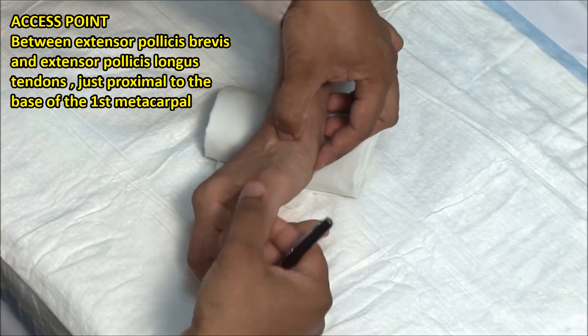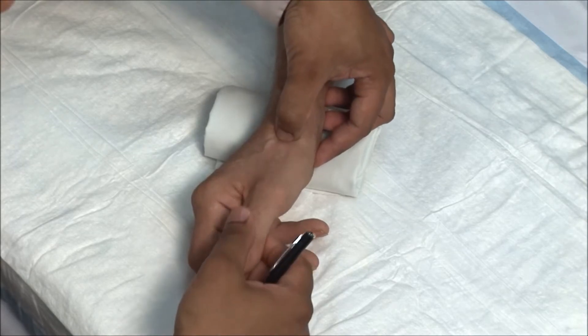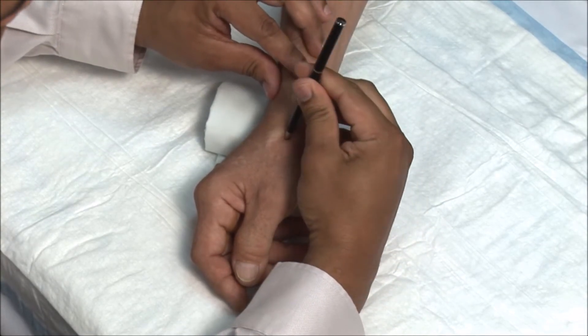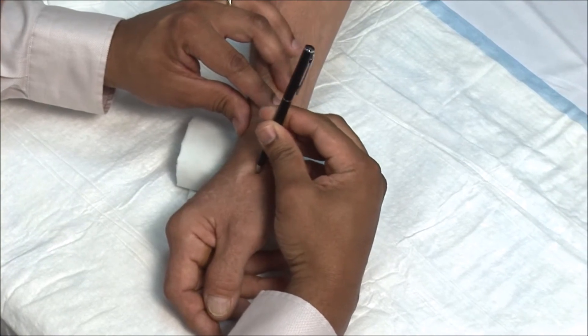Palpate the joint space while flexing and extending the thumb. You can use your thumbnail to mark the point of injection, or you can use a retractable pen. Remember that the point can shift when the thumb is flexed during the injection.